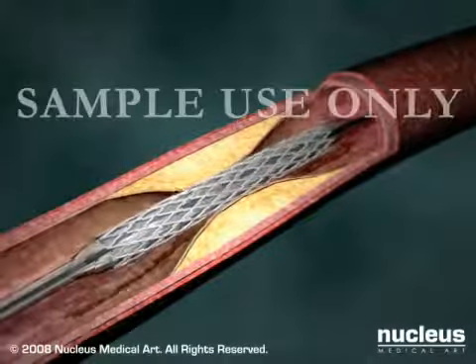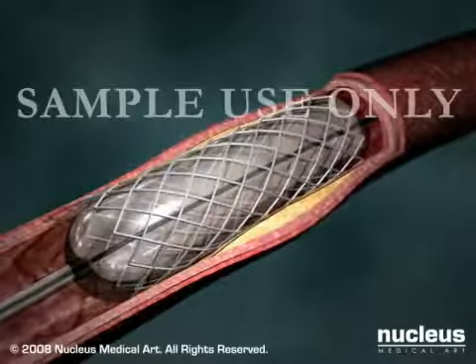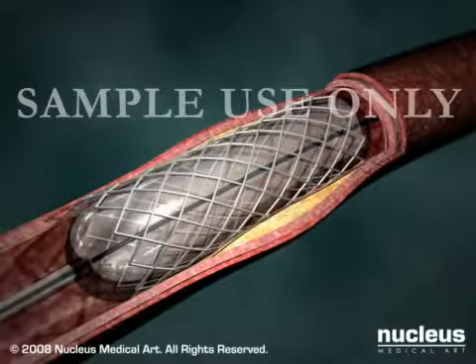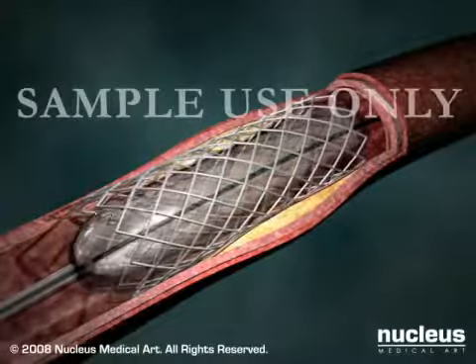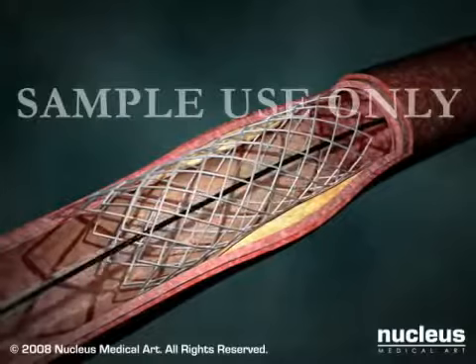A collapsed stent is placed over the deflated balloon as it's moved into position. When the balloon is inflated, the stent expands and locks into place. After the balloon and catheter are withdrawn, the stent remains behind to hold the artery open permanently.